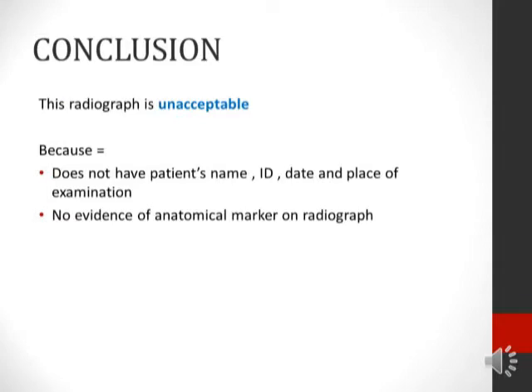And lastly, the conclusion for that radiograph is unacceptable because it does not have patient's name, ID, date and place of examination, and there is no evidence of anatomical marker on the radiograph.